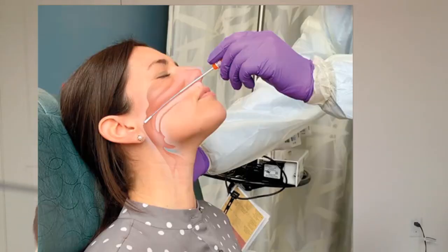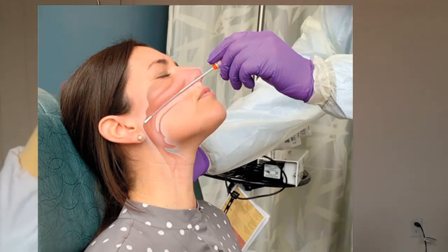The first thing you do is that the sample is taken from the throat using a swab, or nasopharyngeal. The swab goes through your nostrils and has to go way deeper at the back so that you're able to get a proper sample there. The idea is to extract any viruses that are in there so that you get a better sample quality.